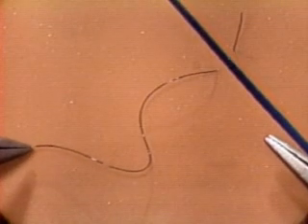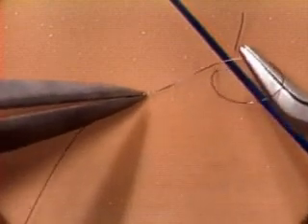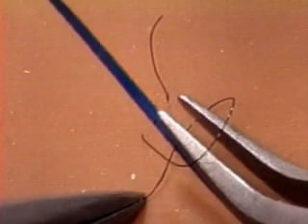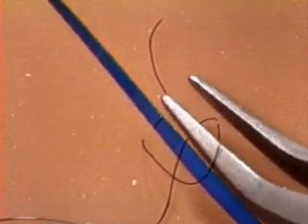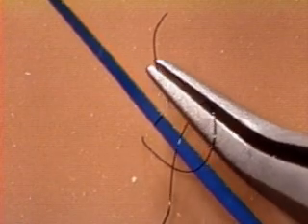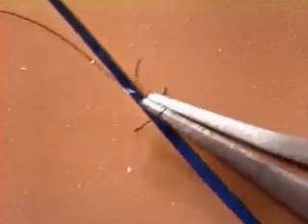The third way to lose the loop is to make it somewhere far away from where the knot is going to be, and then make a journey with the loop poised on the forceps. In the course of the journey, it's easy to lose the loop. In addition to losing the loop completely, there's a strange problem that arises if the loop ever falls just halfway off the forceps like this. If you don't notice what's happened, you go ahead with Act 3, and when you get to Act 4, the loop won't come off the forceps because it's trapped. If that happens to you, you'll know what went wrong.